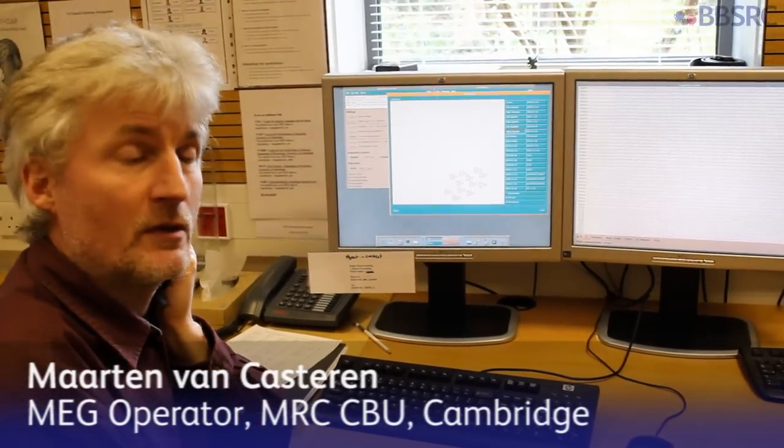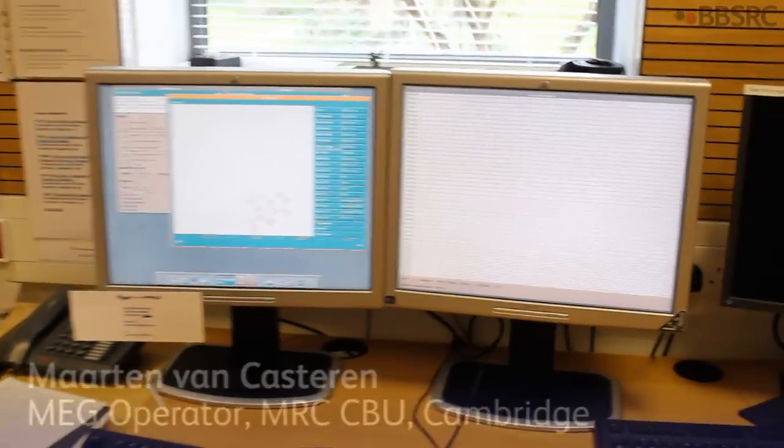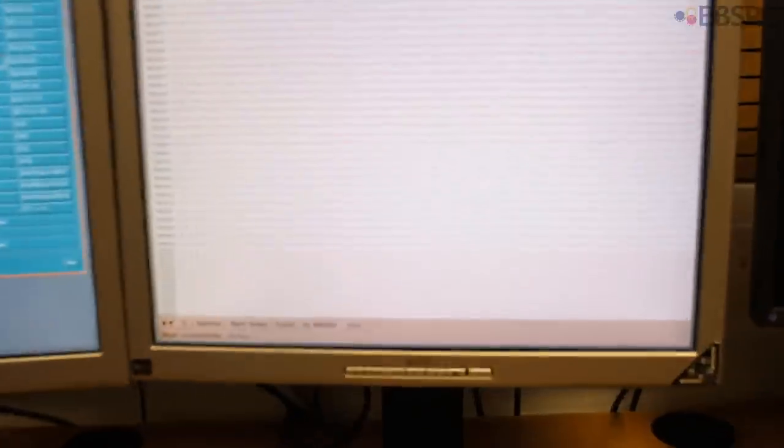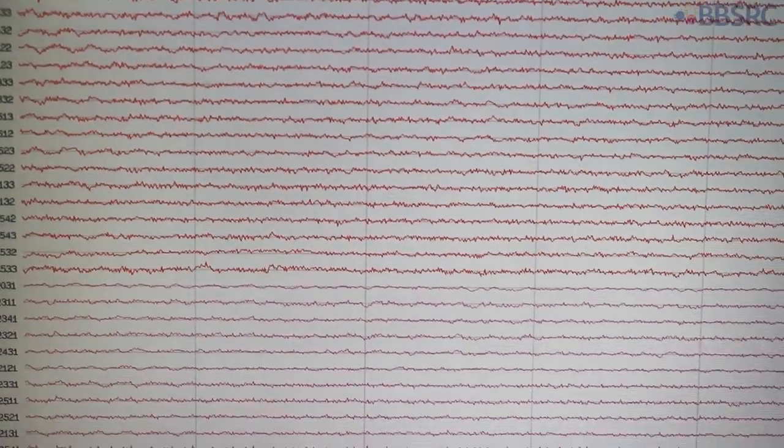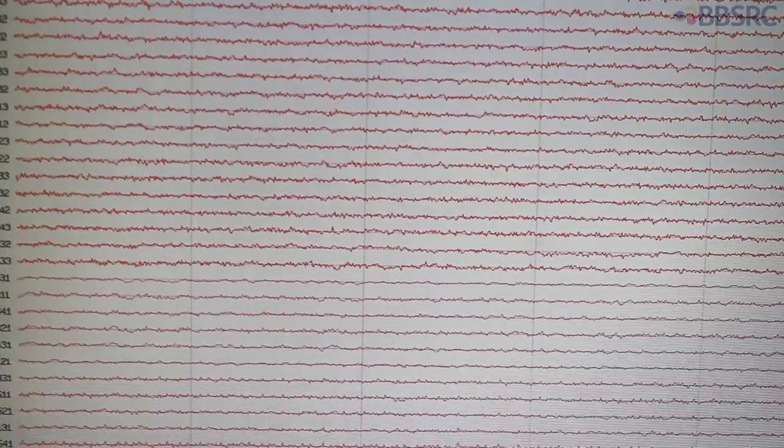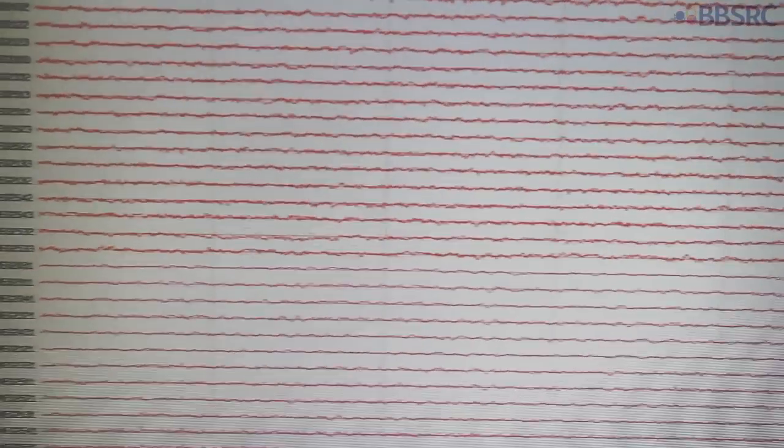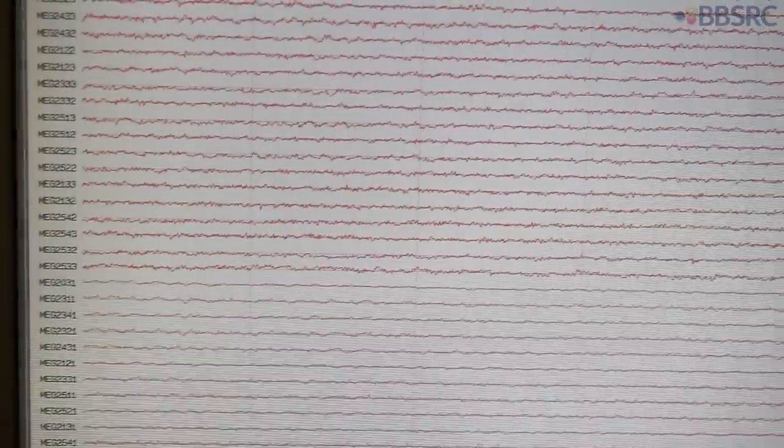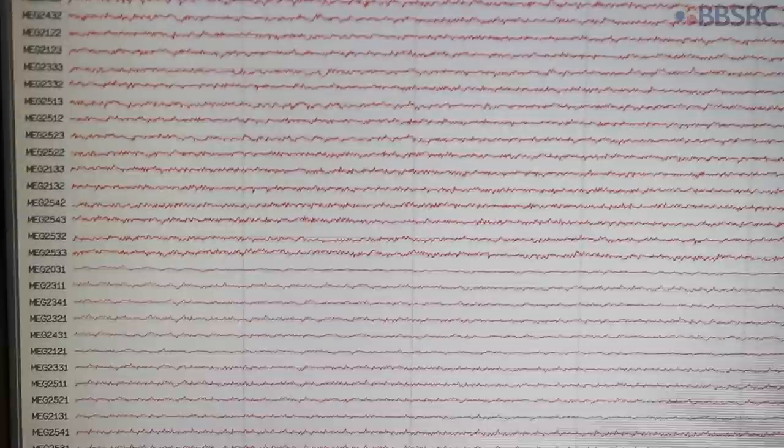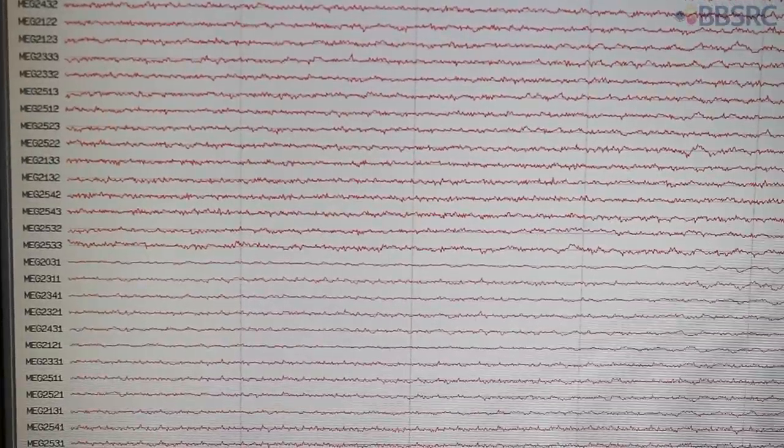That's what it looks like - wavy lines. This shows electrical activity somewhere in the helmet, which only becomes meaningful after extensive data analysis. That's why we do the MRI scan as well, so we can relate it to the brain structures.